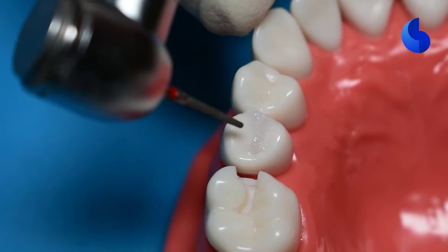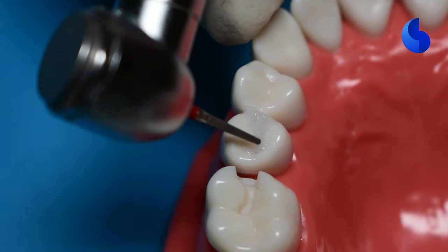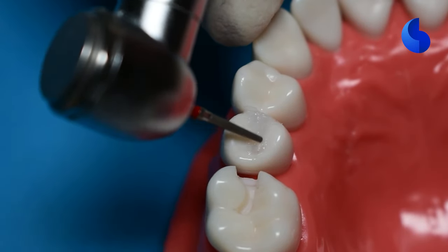Once you've completely cured this restoration, now you're ready to finish this. So you can use any tapered fissured burr, but a red striped one, in a slow speed. And start by refining your restoration by running it across your lingual incline of your facial cusp and then the buccal incline of your lingual cusp and defining your central groove.